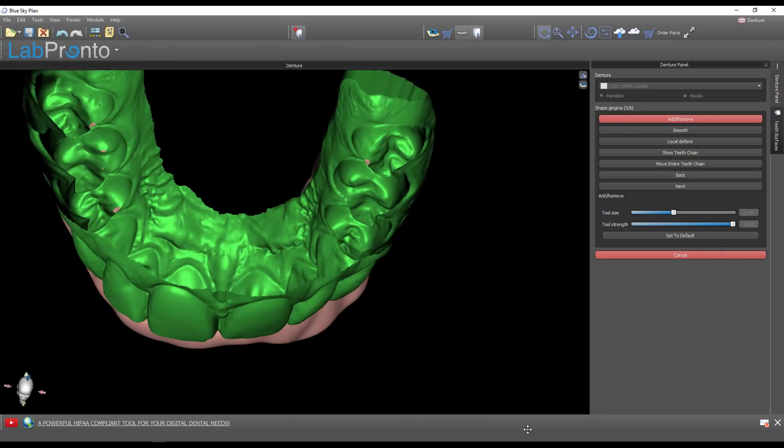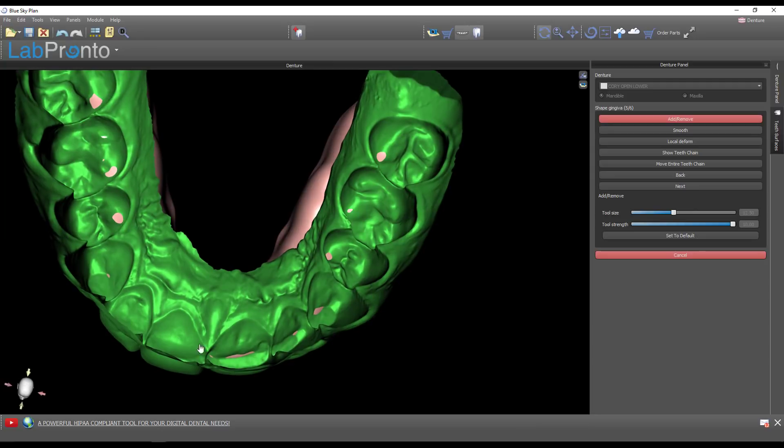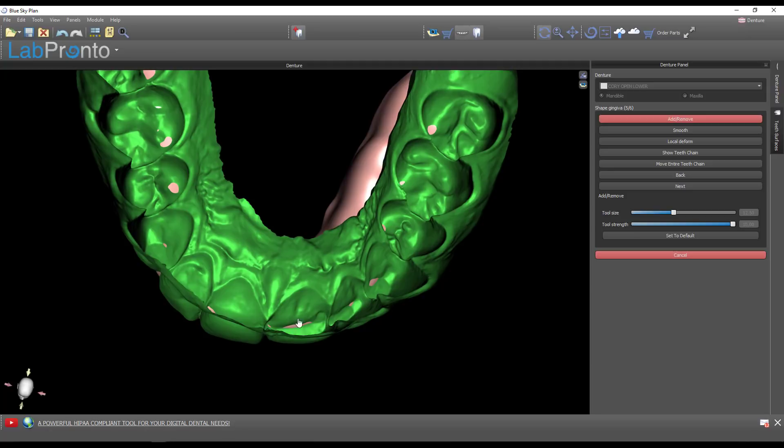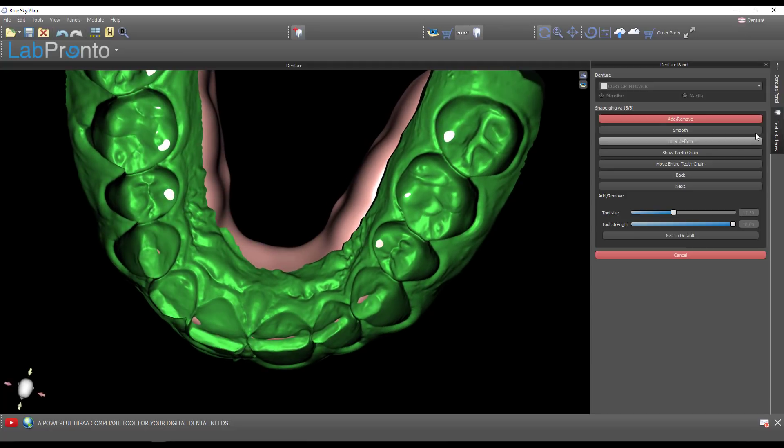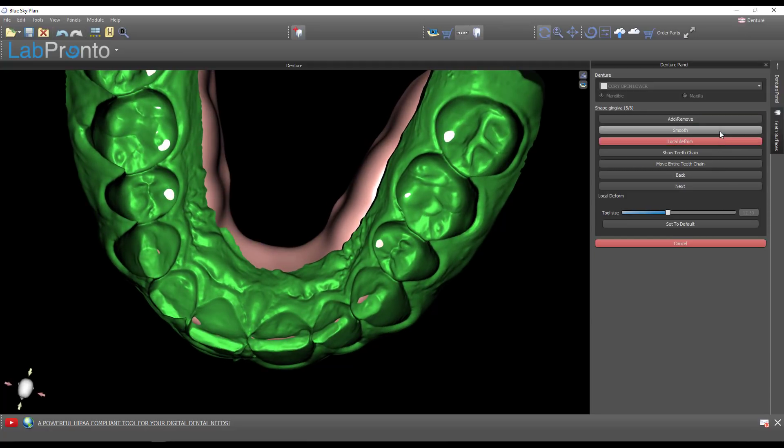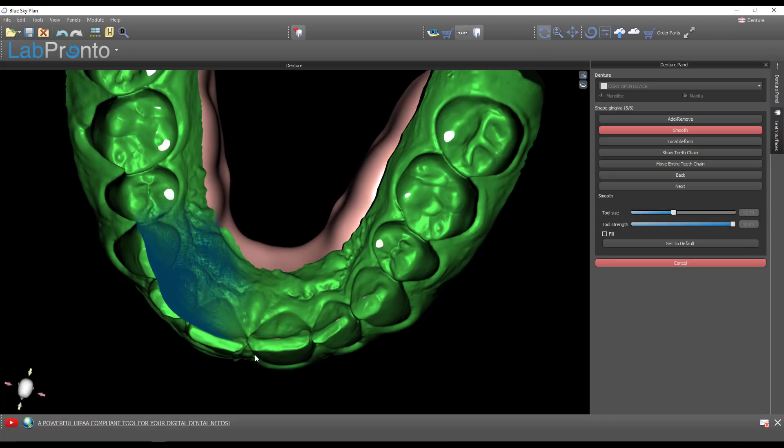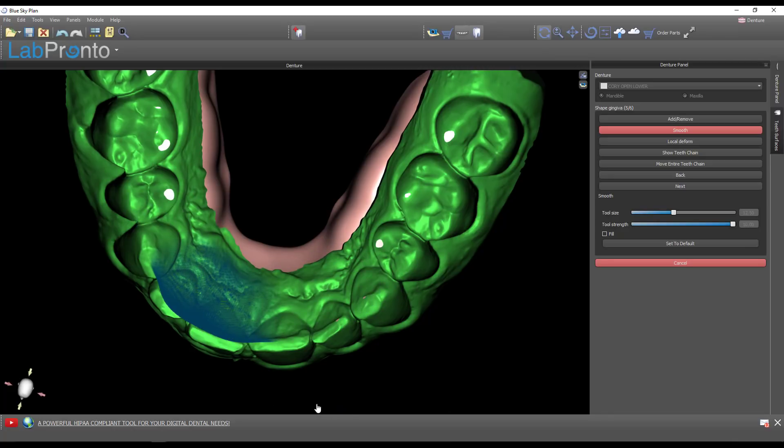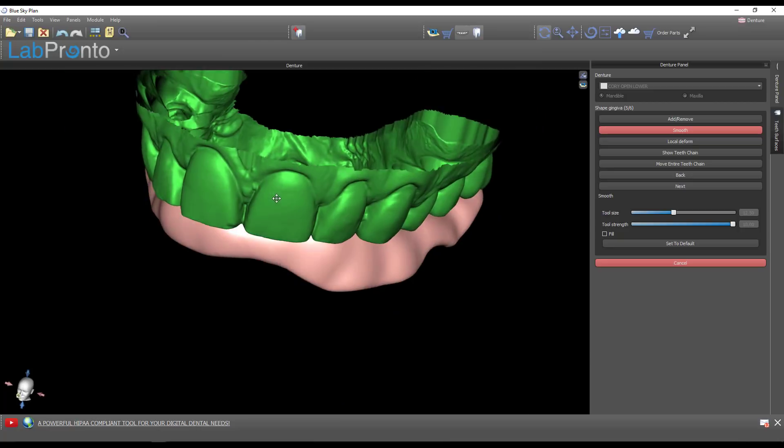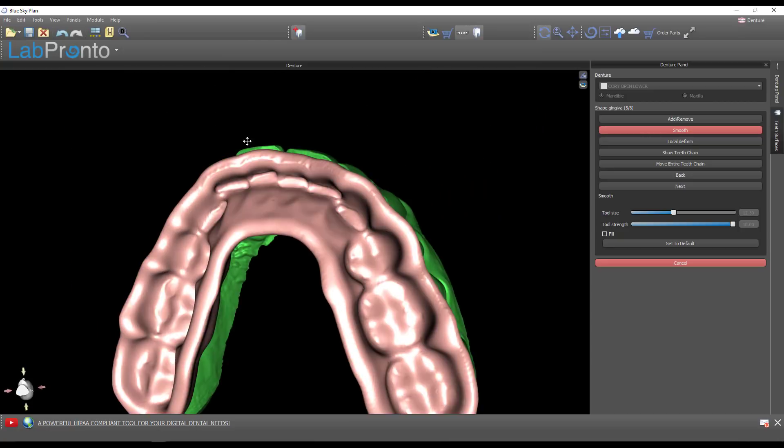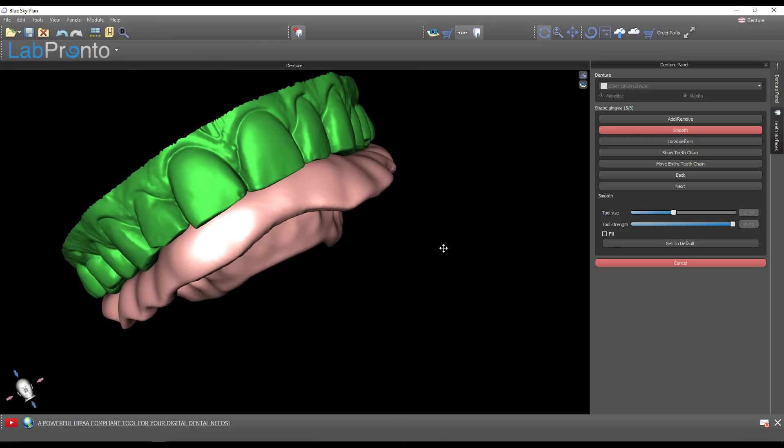That's looking really nice. If you wanted to add material, just hold down the shift button. I'm going to smooth those anterior contacts just barely out of occlusion. Done. This is the completed guard.